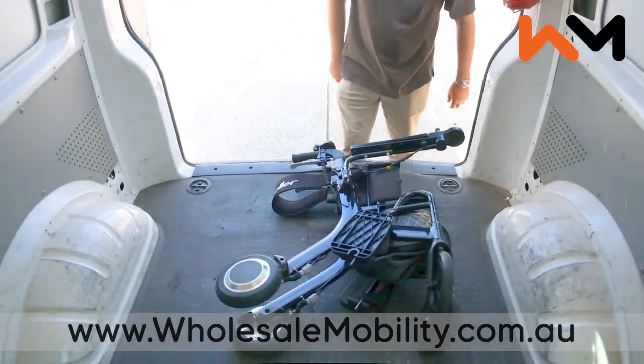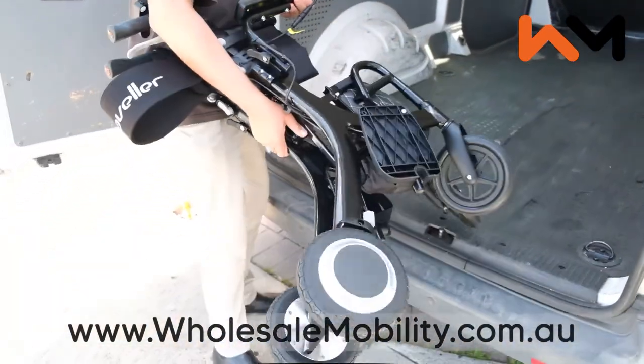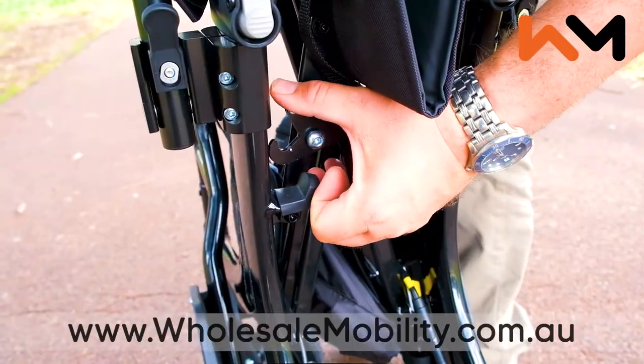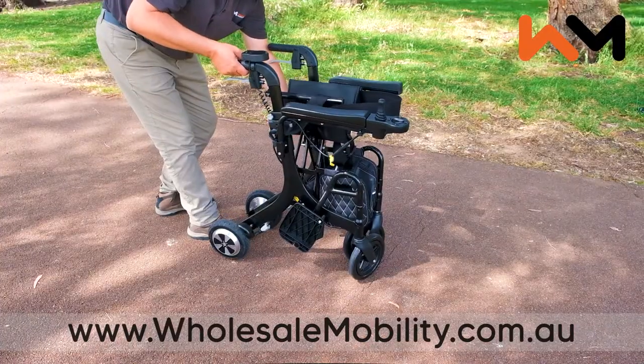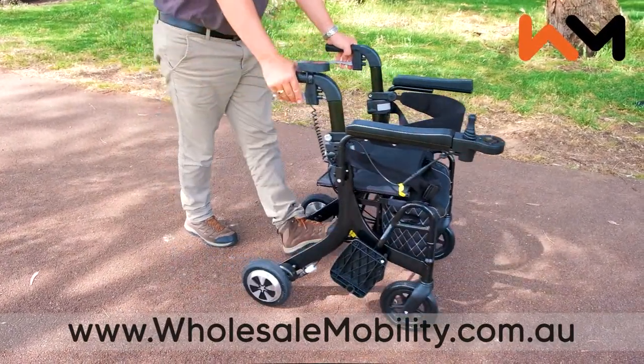You can now load your Evo into the boot of your car or place it in the back seat. Weighing under 19kg including batteries, the Evo is lighter than most electric mobility aids. To unfold, ensure the little latch is undone and pull the Evo apart, pushing down on the seat to ensure it's locked in. The Evo is now ready to go.